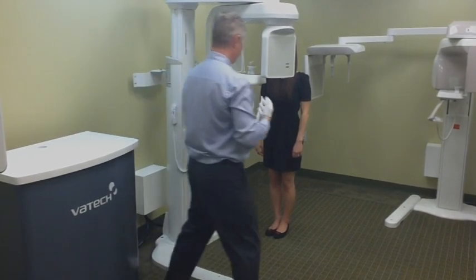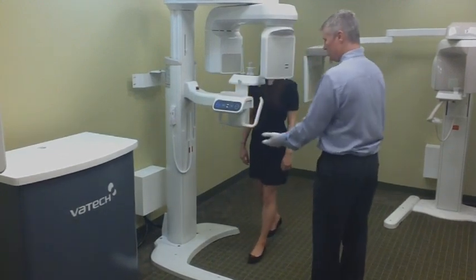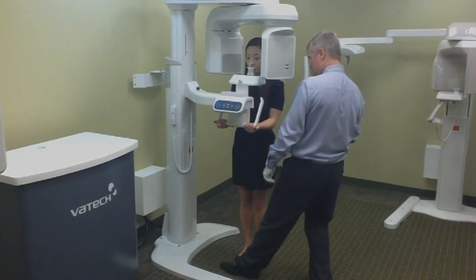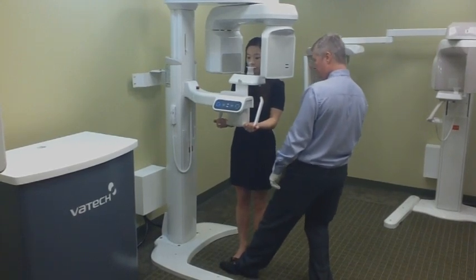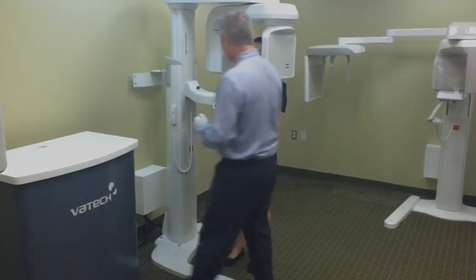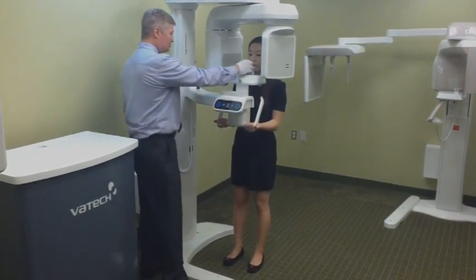Okay? So from this standpoint here, come on forward into the device, and put your hands at the very bottom of the bar. Put your hand like that here. And go ahead and slide your feet forward to hit my feet. Perfect. And if you would, keep your feet shoulder width apart as well. Great. Come over here. Now I'm going to bring the machine down just a little bit here for you.